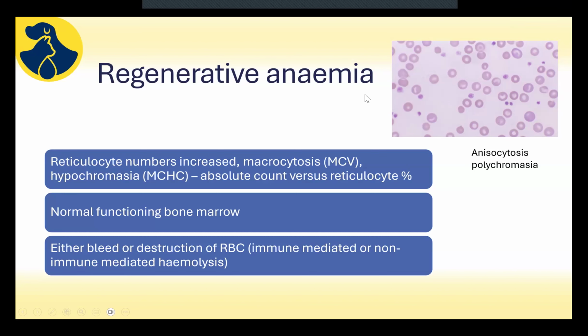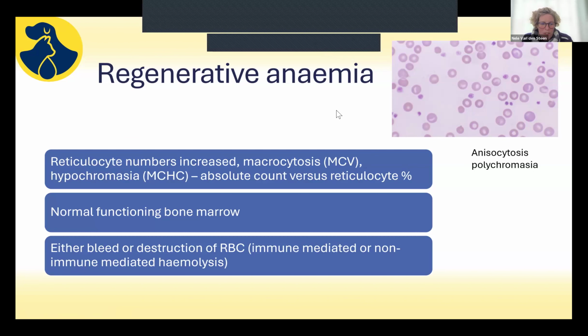As we said, you require a normal bone marrow to do this.